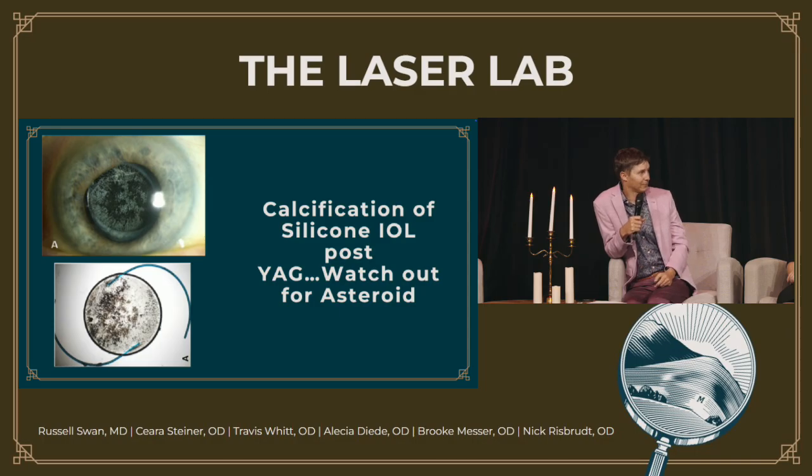So then, because they wouldn't have the capsule anymore, you do a sclerally fixated exchange here? Yeah, good question. If this patient had needed an exchange and still had a beautiful anterior capsule, you could theoretically exchange this lens, put the new lens in the sulcus, and even do an optic capture. So the haptics would be in the sulcus. The optic you would dunk behind the anterior capsule if you still could, and they'd do really well.